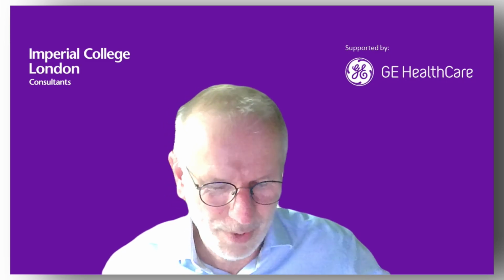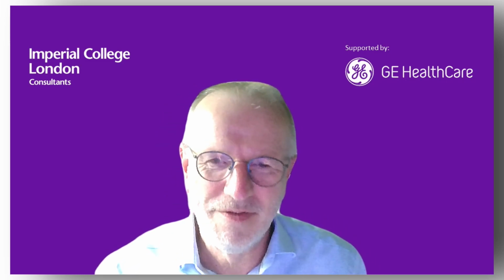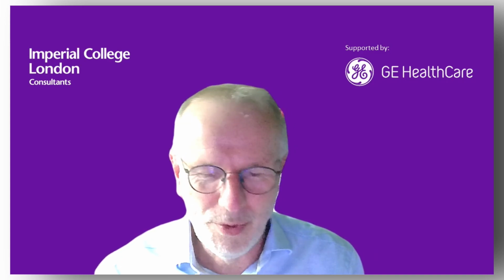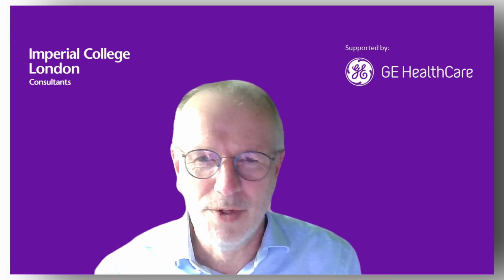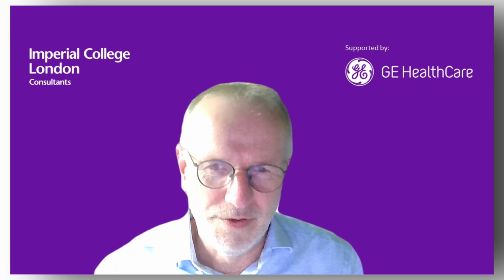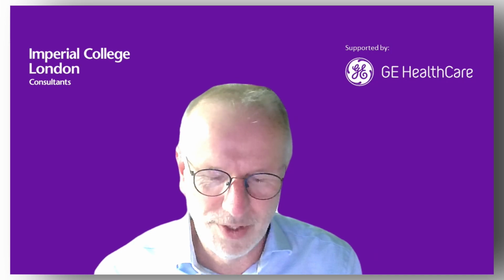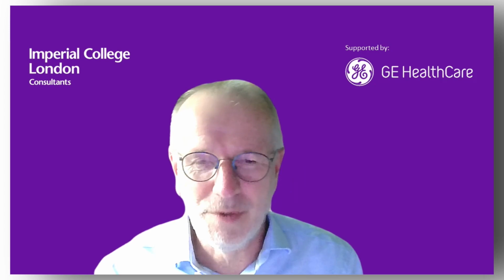Yeah, thank you very much, and thank you also for the request for a deeper explanation of the technology STIC. STIC stands for Spatial Temporal Image Correlation, so that means that you make a 3D sweep of the fetal heart. In the beginning you saw a lot of publications on STIC, but the Voluson engineers also said there could be a bit of time pressure when you make a STIC.